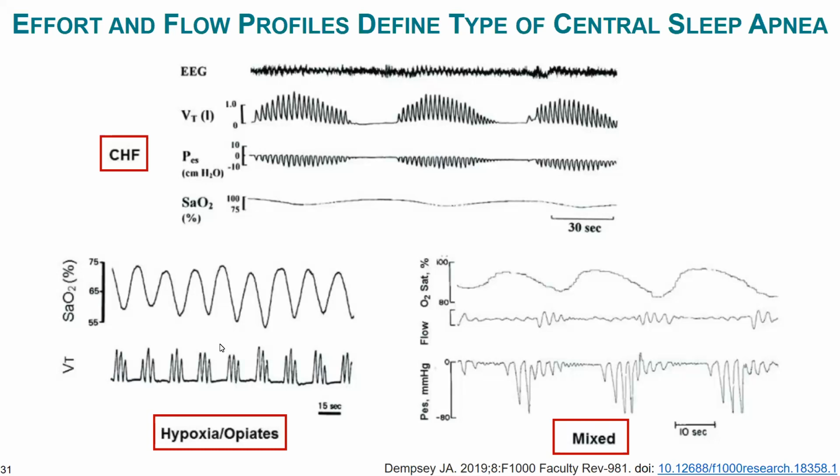And the cluster breathing pattern is one of abrupt start-stopping of ventilation. This is characteristic of patients who might be on moderate to high doses of methadone, where at the moment they go off to sleep, they begin these very short central apneas, punctuated by 2 or 3 resuscitative breaths, but the breaths are more or less symmetric. There's not that sort of sudden increase in ventilation at the start of the arousal phase, but rather abrupt breaths or ventilation that lead to a much more symmetrical cardiopulmonary signal pattern.